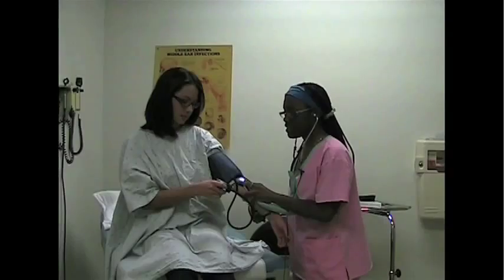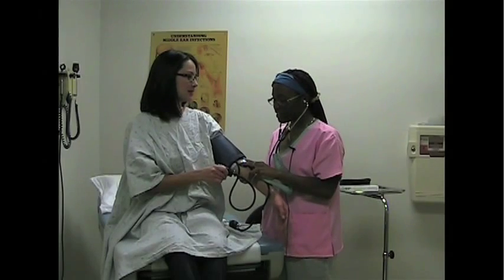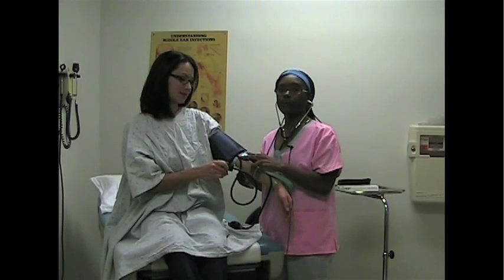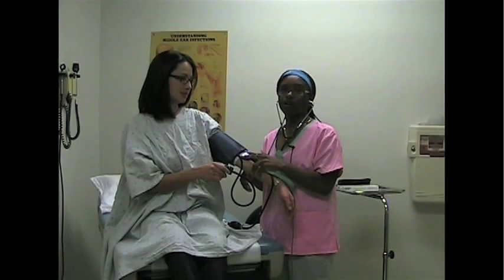I'm pumping it up to 170. Her blood pressure is 100 over 70, which tells us the systolic number — the high number — is where the blood is being pumped through the body, and the 70, the low number, is where the heart is resting between the two beats.